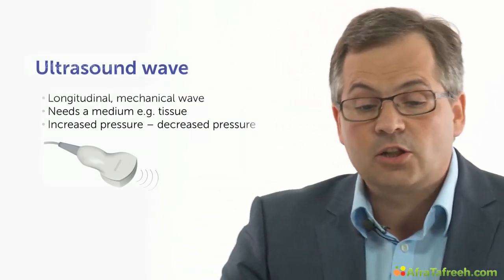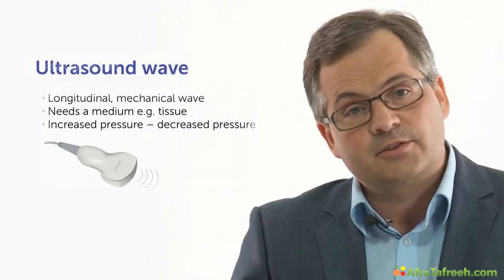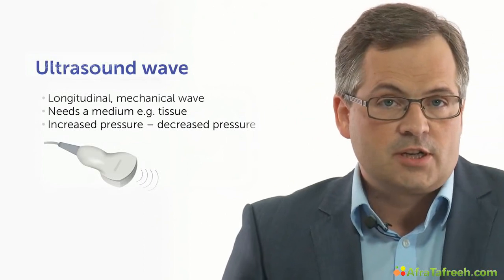Ultrasound in a medical diagnostic setting is a mechanical wave based on a rather high frequency. We use frequencies from 1 MHz up to 15 MHz. The ultrasonic wave is a mechanical longitudinal wave. We have areas of increased pressure and areas of decreased pressure, and these changes of pressure travel through the tissue. So we need a medium, a tissue through which the ultrasound beam can pass.